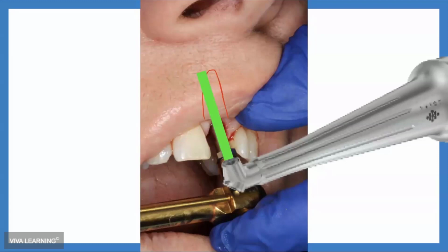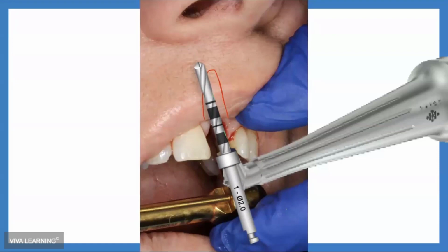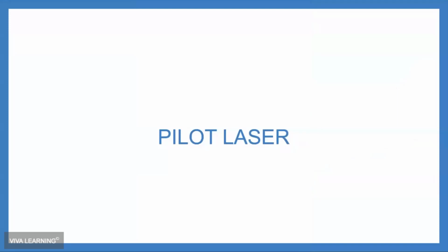And when it's done, I have a protocol for this. We don't have time to get into it right now, but after a prescribed amount of time, you turn the laser off and you have a little bit of a notch in the palatal section of the socket. And what that then allows for is you to put your drill into your guide, and then you don't get any deflection. So for me, this has been an absolute game changer as it relates to being able to do more predictable same day immediate placement implants, specifically in the anterior, but this technique applies in the posterior as well.